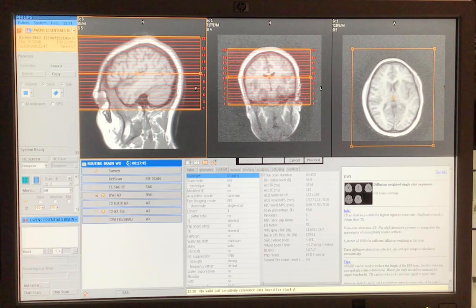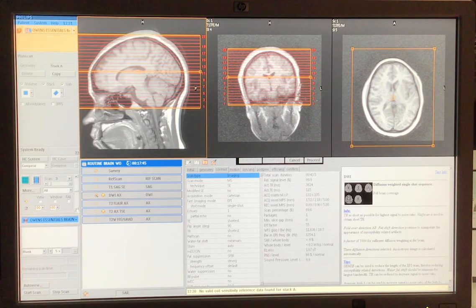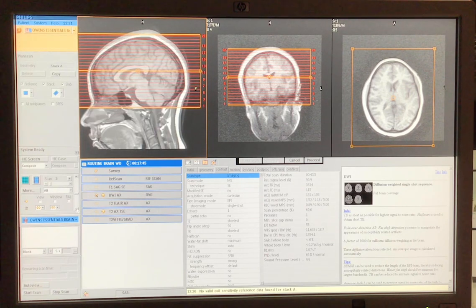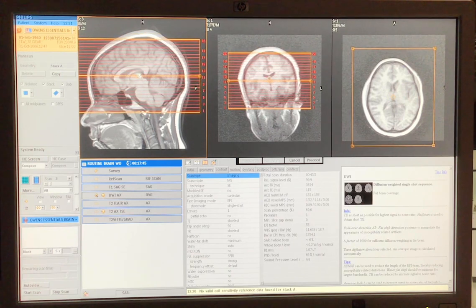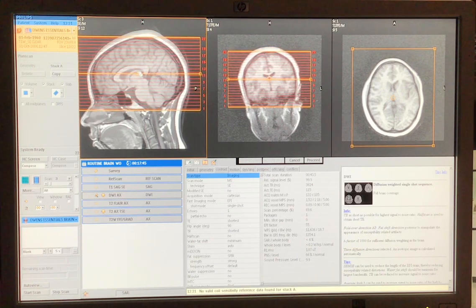And again, if you just page down through this vertical bar, I'm going to go through each of these sagittal slices till I get to the center, which is about here, right? Now I can see my corpus callosum real nice. I can see the very tip of my cerebellum here. And if I take these slices, I want to make sure I get the entire brain on it, so I don't want to miss anything. I don't want to take my first slice right away in the brain, so I'm going to bring it down a little bit.